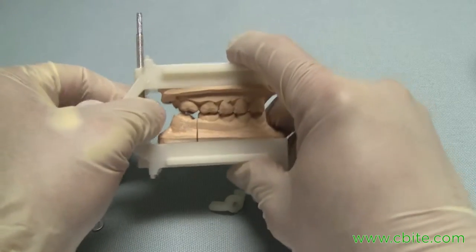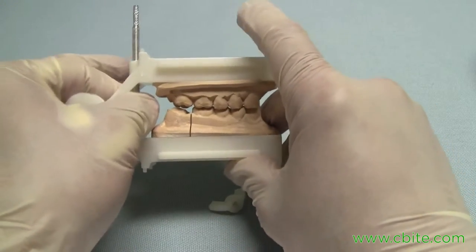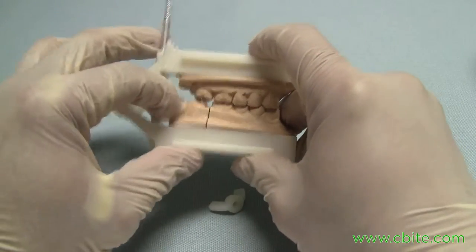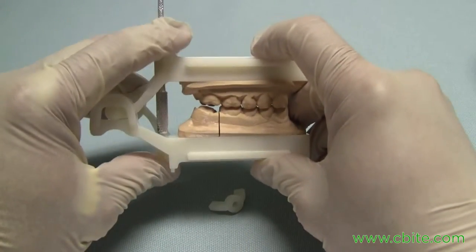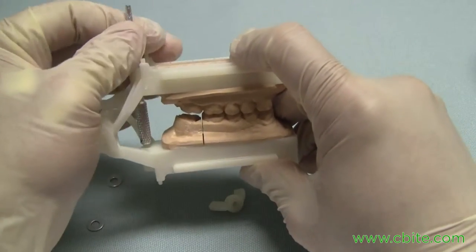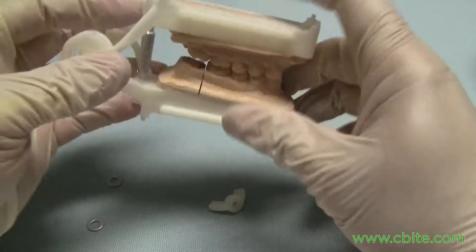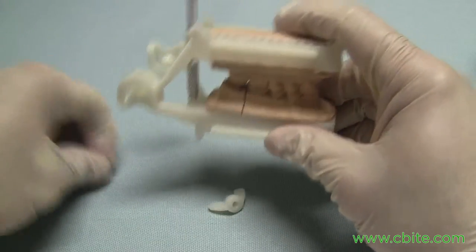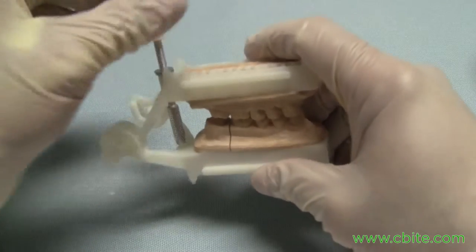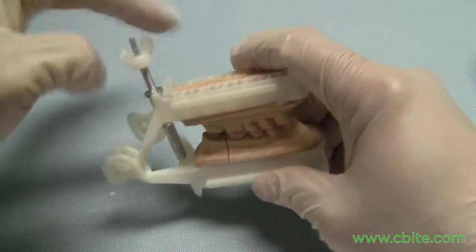Once you've got that membrane cleared, you can feel it and confirm you've got the support — it's pretty strong. Then add the two washers and the nylon wing nut to lock the pin in place.